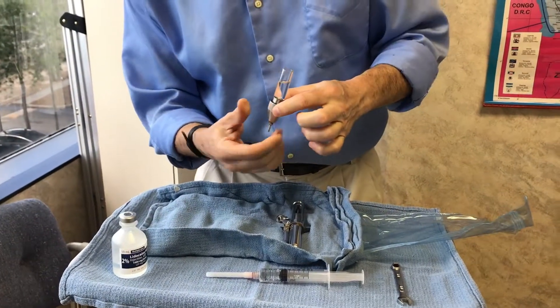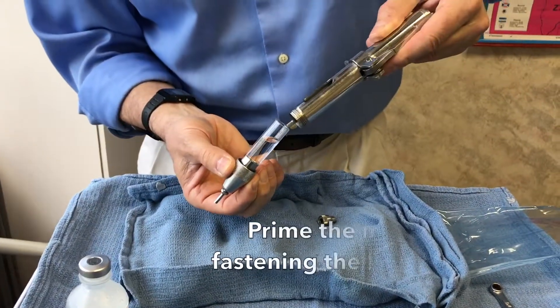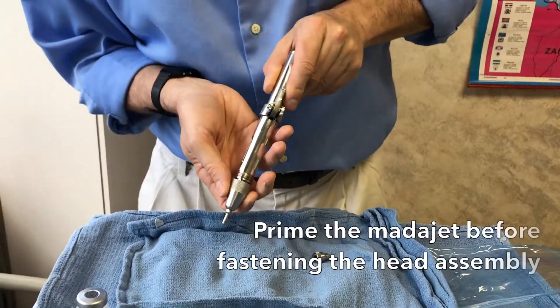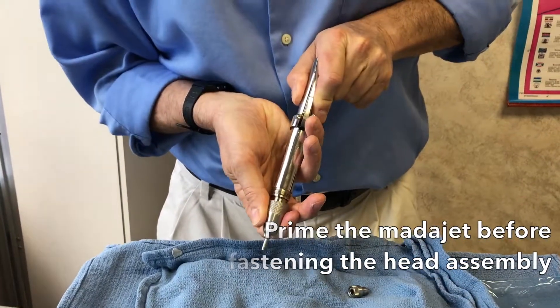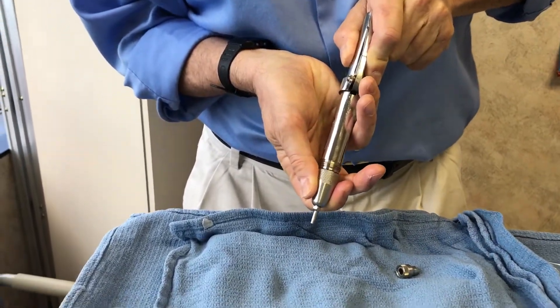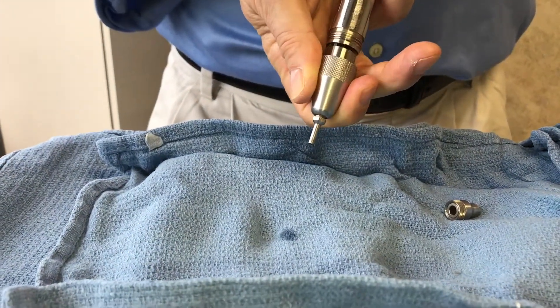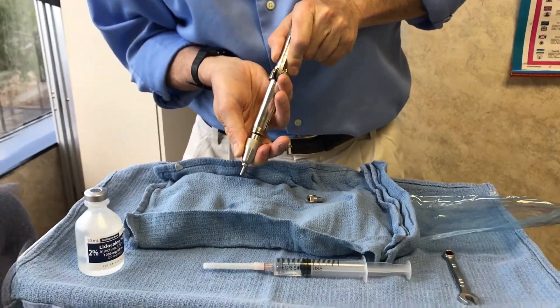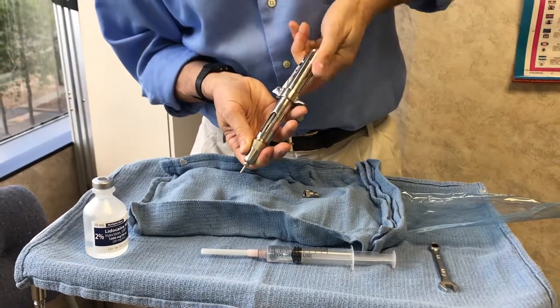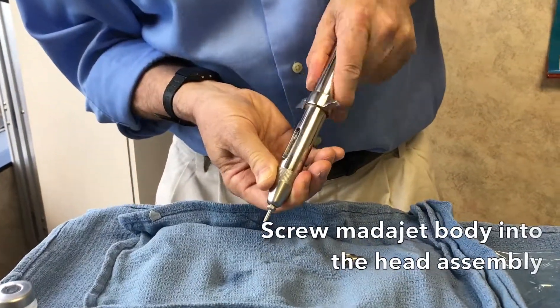Now remember that there's still air in the head of the MataJet. So the first thing I want to do is get rid of that air. We prime it a few pumps and pretty soon you'll start to see the fluid coming out. It took three or four pumps on a sterilized MataJet to get all that air out. Once it's out, I can screw the body into the head.